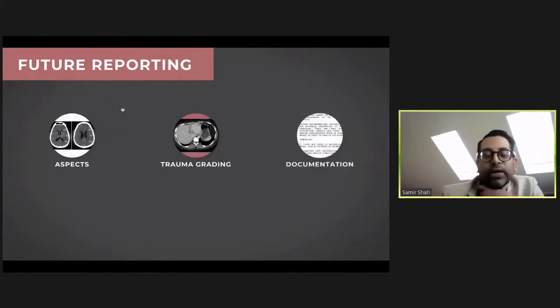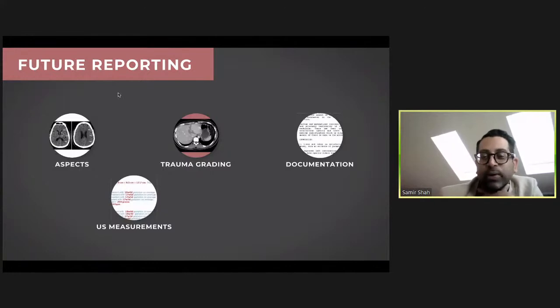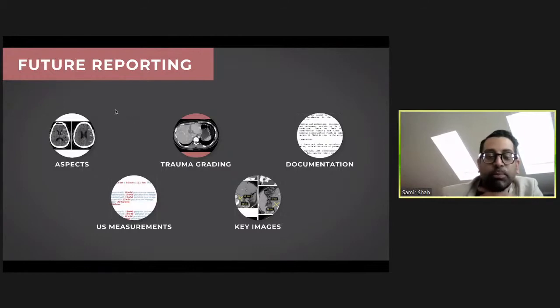So many things that we are asked to do and that we may not necessarily have been trained with are going to become absolutely routine parts of reporting that are filled in, put into the report automatically by AI. With stroke imaging, the Alberta ASPECTS scoring scale is becoming more and more common, but most radiologists haven't been trained with this. So they want to implement it, but they don't want to delay, because any moments that you delay reporting a stroke study is time is brain.